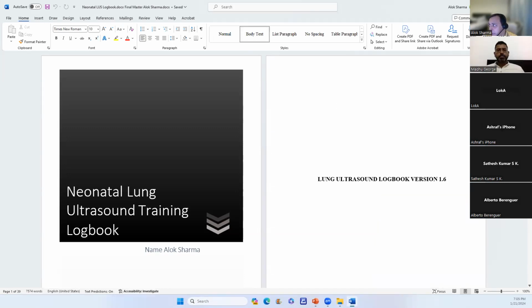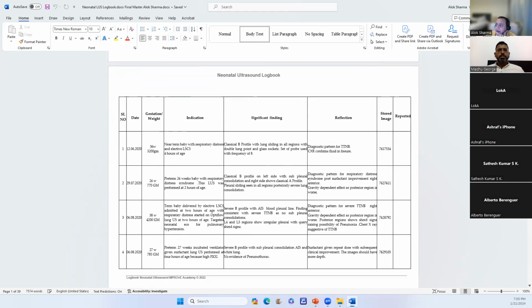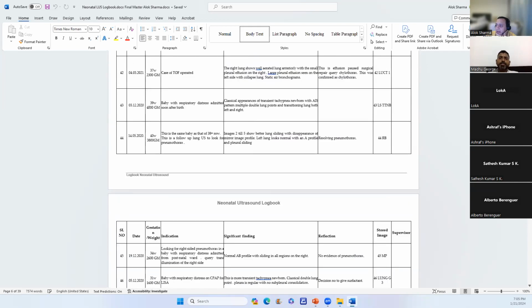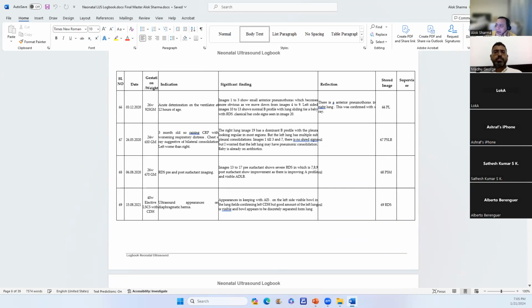Yes, okay. So basically, from my perspective, you can see how I have logged images, and I have hyperlinked files. If I click on this particular file, I can actually open the PowerPoint presentation which stores the images, which go back to my logbook. And I've just kept a log of all the images that I've kept over time as proof.